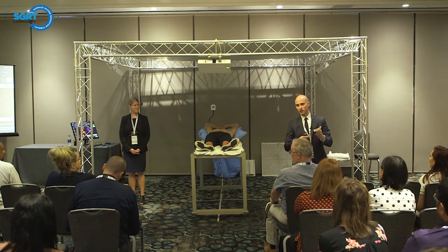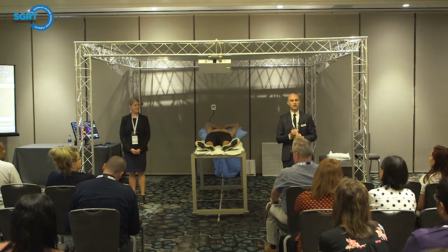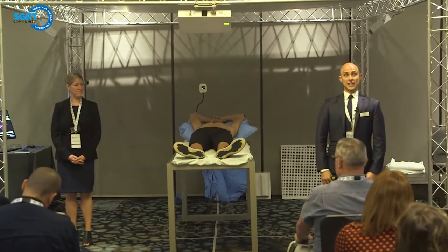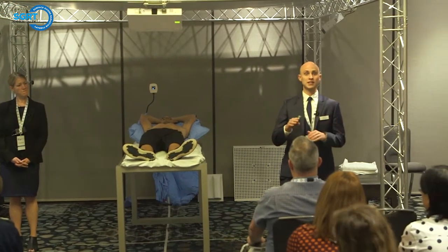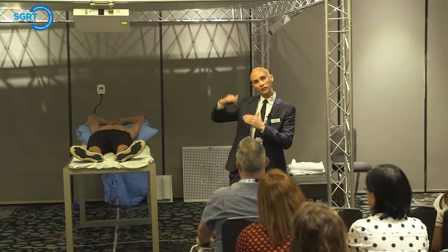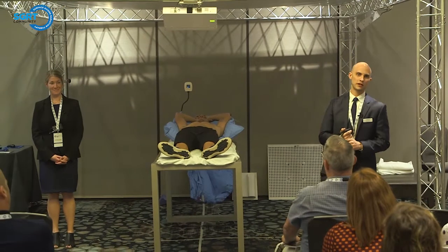The other thing is to tell them to take 80% of their total lung volume, however you want to explain that. Sometimes you say deep inspiration, and it's, "I can't take any more in or let any more out." Then it's really difficult to assume that same position in the treatment room, right? So if you tell them 80%, they have a little leeway in the room to say, okay, take more in, let some out, and that helps a lot.